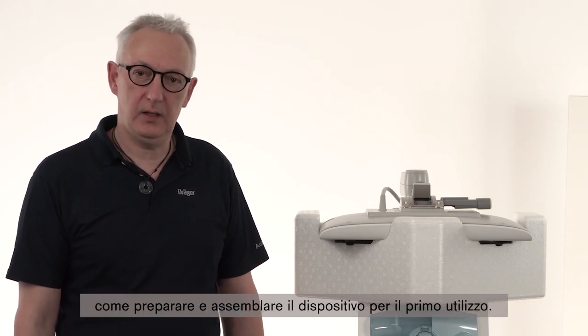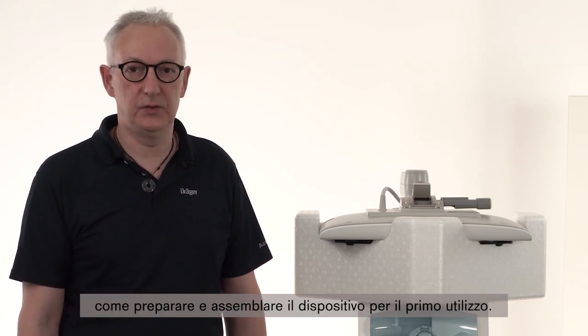Hello, in this video we will introduce you how to prepare and assemble the device for the first use. My name is Michael Klein, Draeger Academy, at the headquarter in Lübeck.